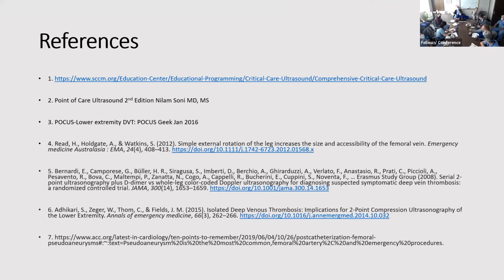Back to the billing question. CMS has certain guidelines to bill for ultrasound. At Eskenazi, we have a smart set for this. You have to put your name, the patient's name, the indication, a little bit of a summary about what you think is going on with the patient. You have to put the ultrasound exam that you did, along with the ICD-10 code, a picture, preferably a video, but all we can do at SQ right now is pictures. Then what your interpretation of the picture was, and then what your plan is for what you've done. If you hit all those elements, you can go for the study.